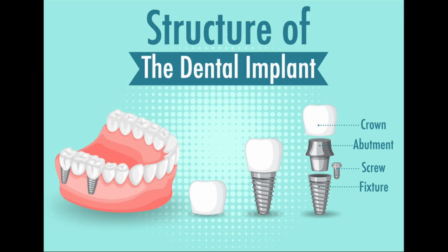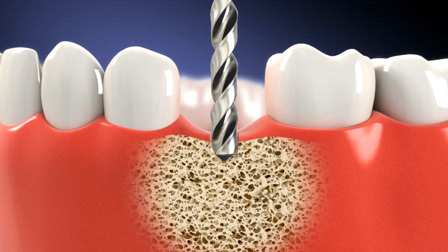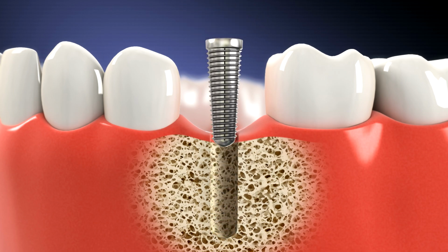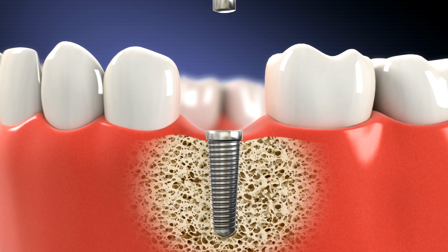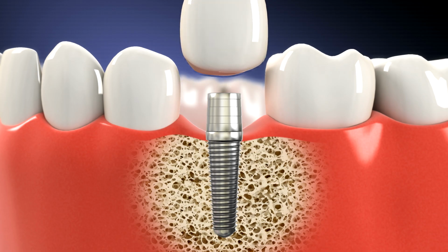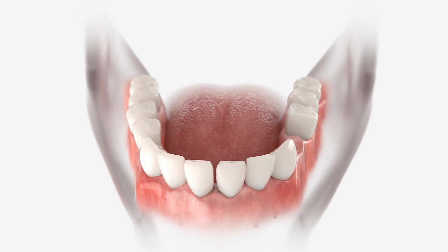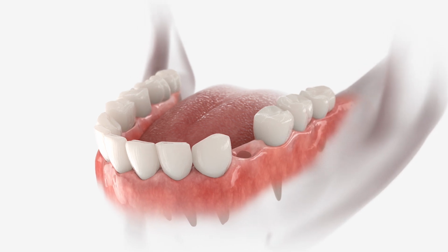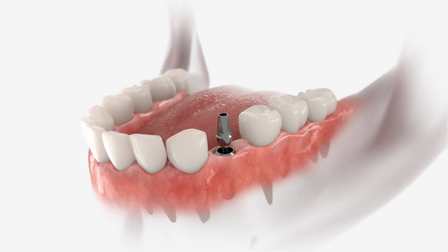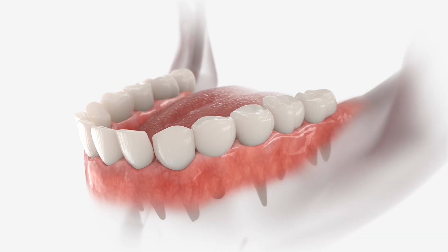3. Microdesign, surface treatment, and osseointegration. The true magic happens at the micro level, the surface and the connection. Surface treatment is paramount for osseointegration. A smooth, machined surface prevents bone integration. Modern implants feature treated surfaces, usually involving grit blasting, SA, followed by acid etching, SLA, or similar. Visual: microscopic view of a porous, acid-etched surface. This micro-roughness increases the surface area for osteoblasts to adhere to, speeding up the healing process.